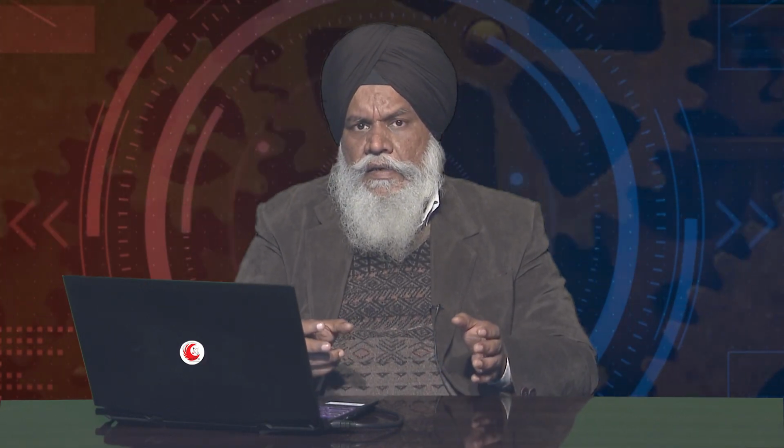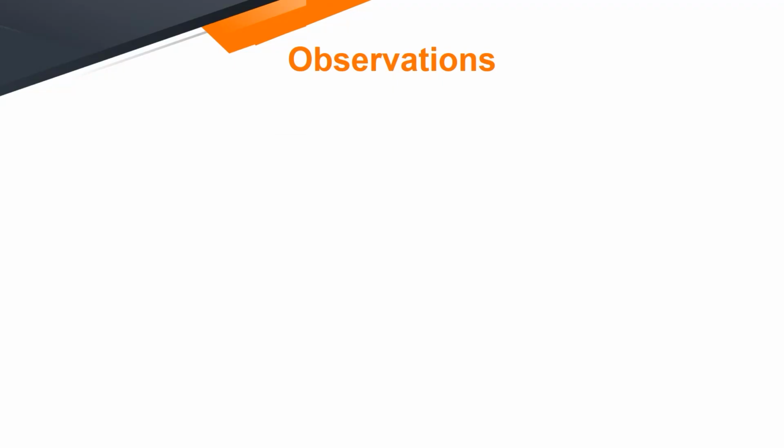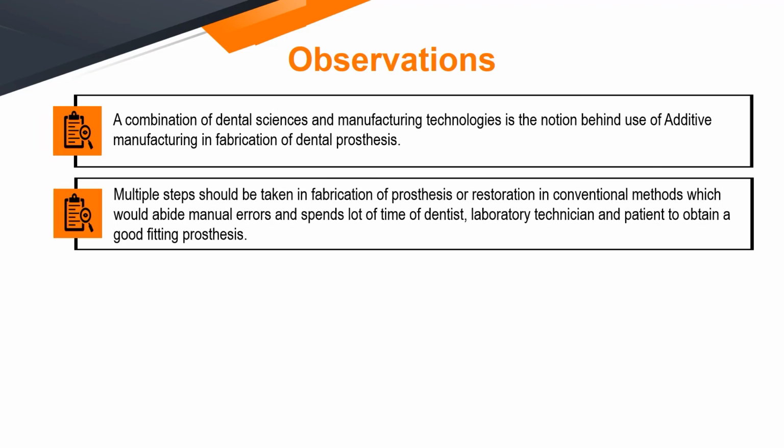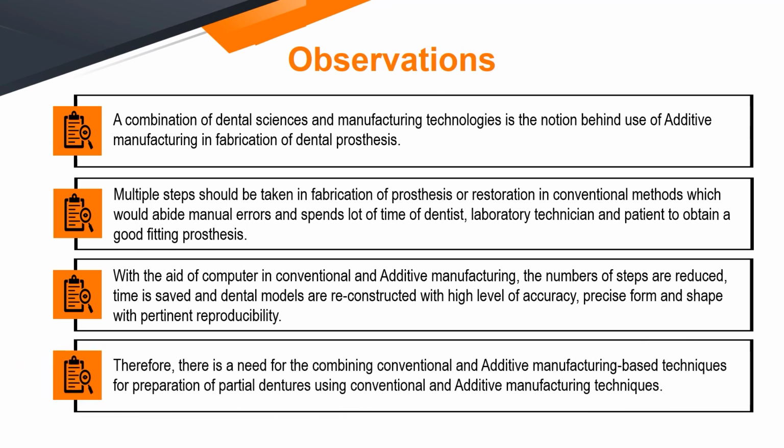So we can give a value addition to our patient, that in place of using a single set of denture, you can have three or four or multiple, depending upon the patient history, how the sugar level is varying. So this will make my denture a smart denture. I hope the information is useful to you, and we can use this type of smart denture for our patients.